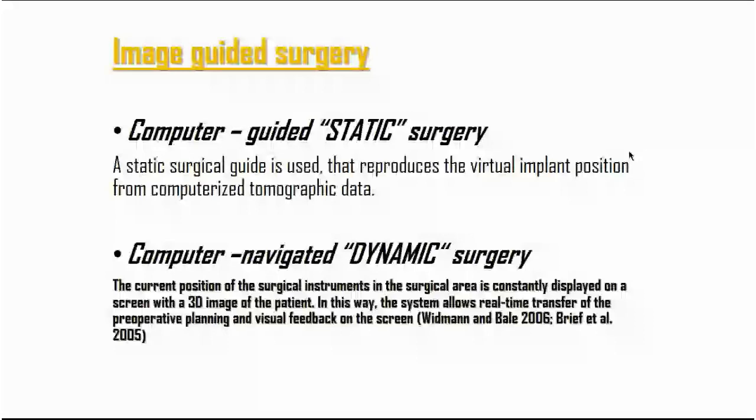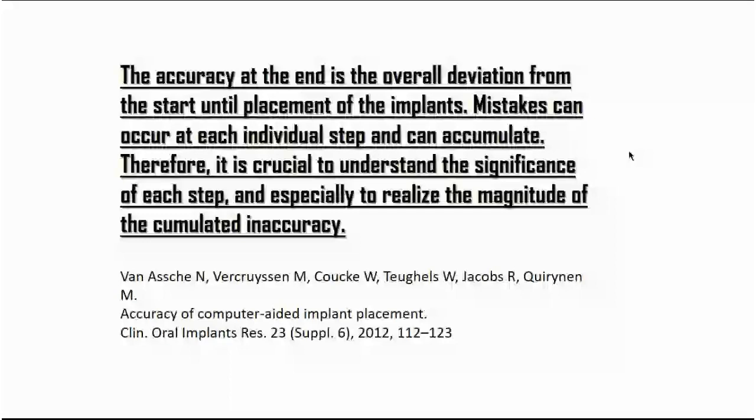And also it will be depending on the economical availability of the systems, which system we will use and how it will impact our data planning.